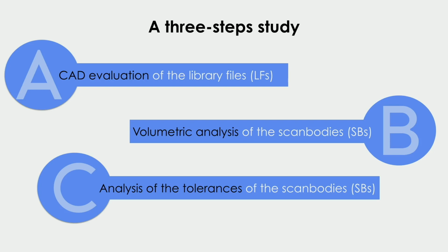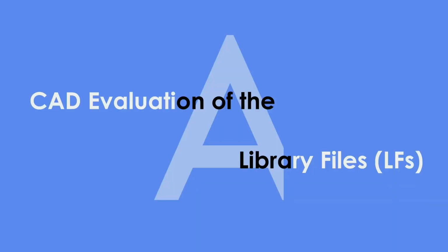We collected this data and put it in one table, then we investigated each single physical sample with optical microscopy and through precision probing with a Renishaw probe machine. We gathered all this data and compared it to the reference data in order to have an idea of the tolerances during the fabrication of the scan bodies. So the first phase was very easy.